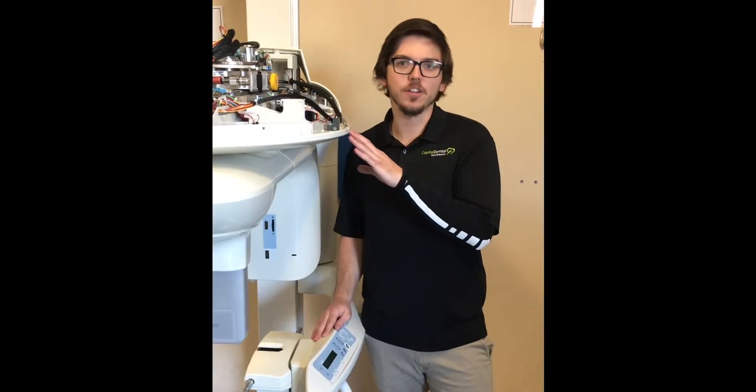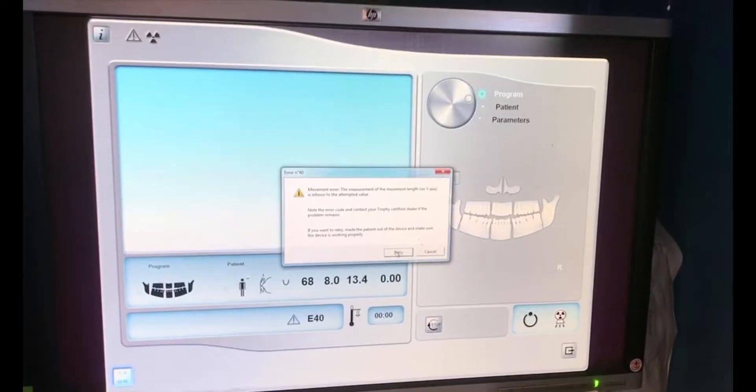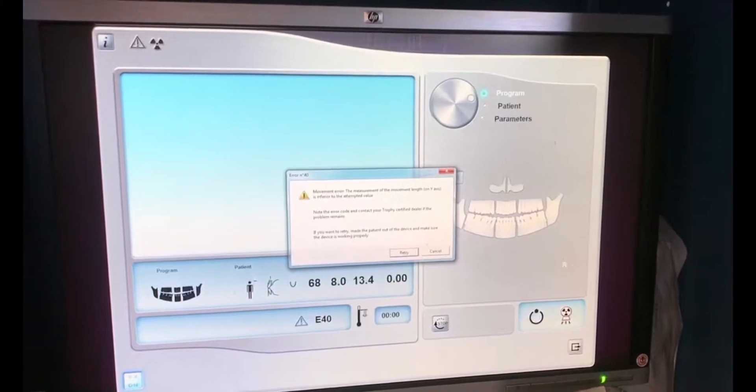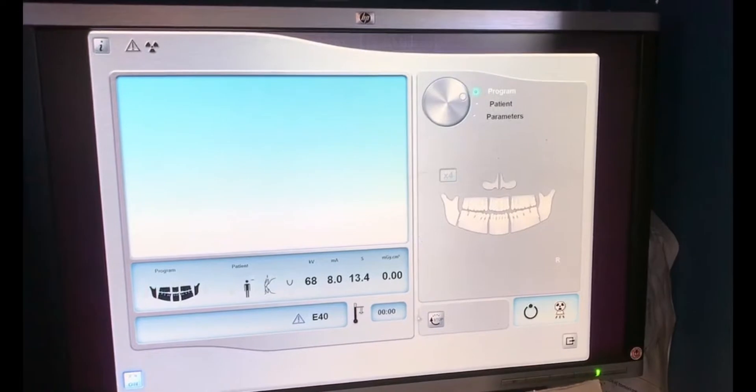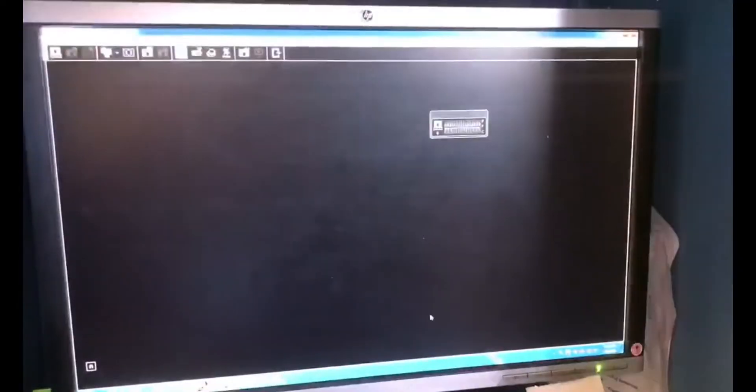This is a common error where the machine basically forgets its home positions. When you receive this error, the first thing you're going to do is open up the acquisition window on the computer. You should see a little error box pop up. You're going to hit retry to clear that out.